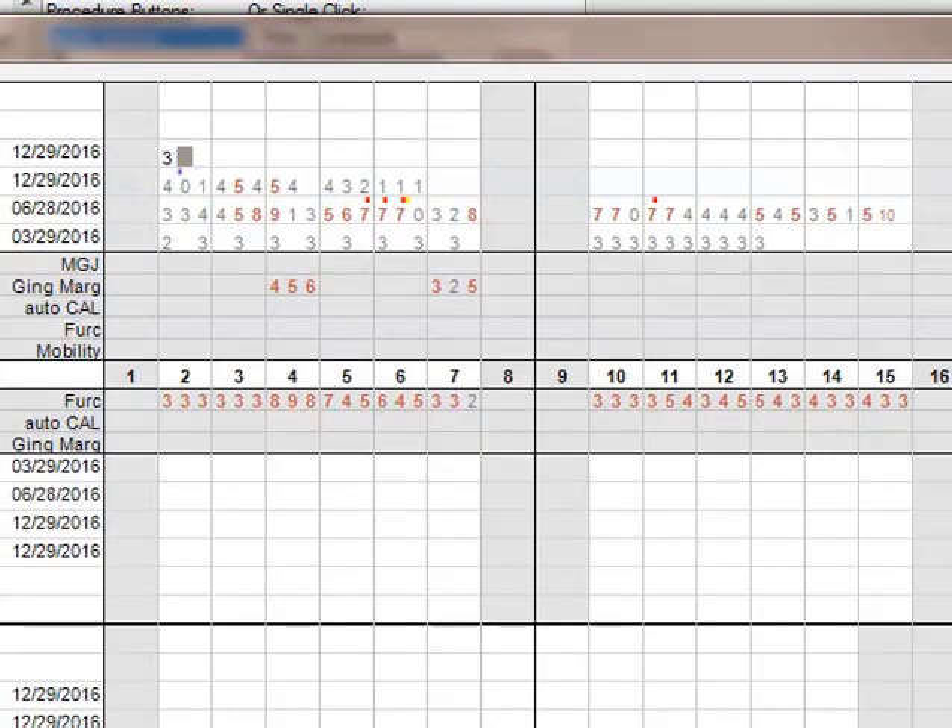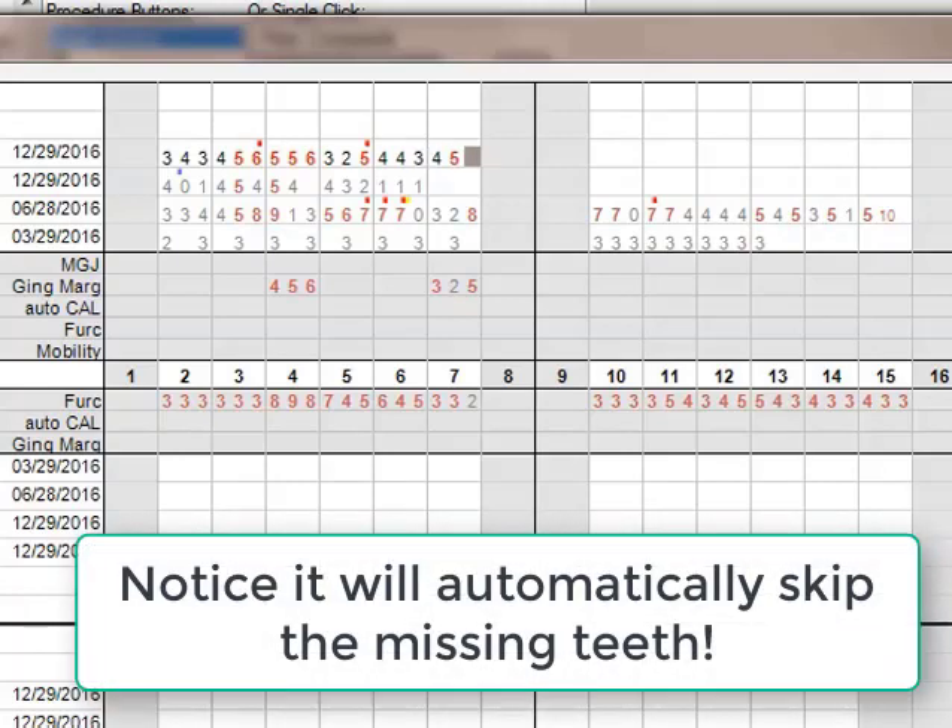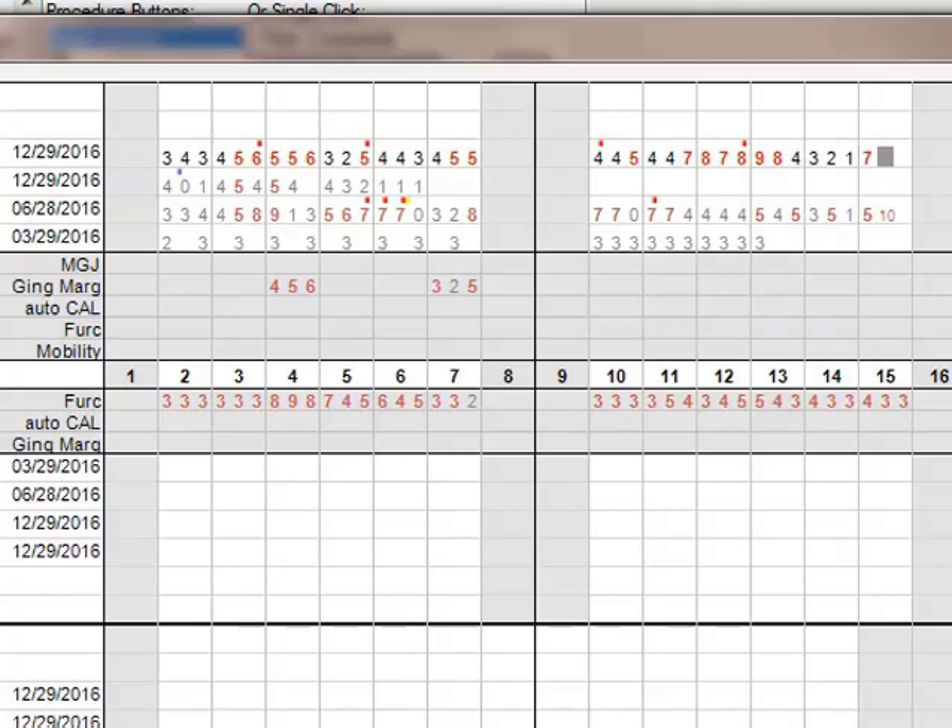Here is the live demo of voice perio charting in action. Pocket depths are called out verbally — three, four, three, two, three, four, five, six, two, four — along with bleeding markers. Tooth numbers are called automatically as the chart advances: tooth five, tooth six, tooth seven, tooth ten, tooth fourteen. Additional depth readings continue — four, five, five, four, bleeding, seven, bleeding, eight, ten, four, four, five — demonstrating the full flow of a voice-driven perio charting session.